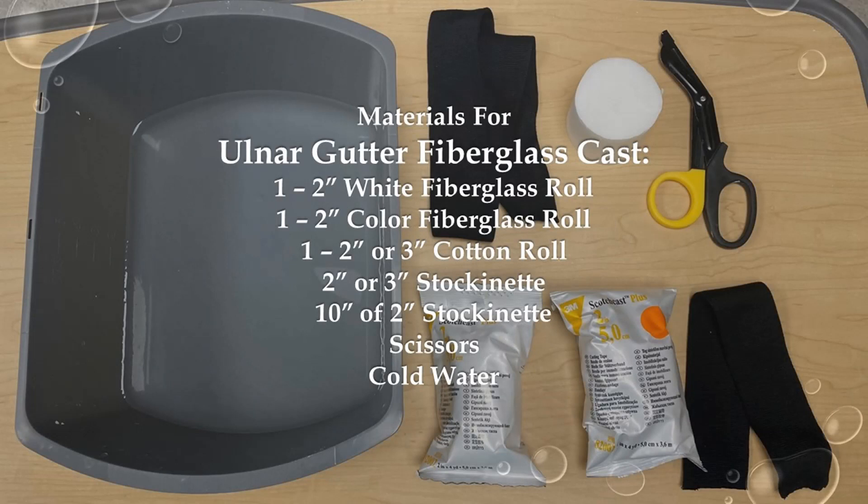Before you begin casting, gather the materials you will need. The amount of material may vary for each patient due to size and age. The materials for the ulnar gutter cast are: one two-inch white fiberglass roll, one two-inch color fiberglass roll, one two or three-inch cotton roll, two or three-inch stockinette, 10 inches of two-inch stockinette, scissors, and cold water.